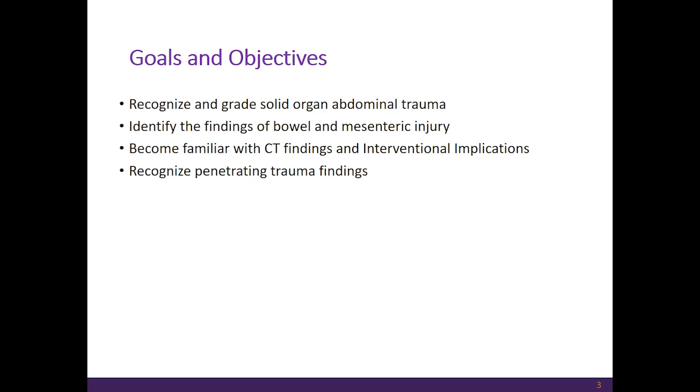So our goals and objectives, hopefully by the end of this talk, you will be able to recognize and grade solid organ abdominal trauma. Hopefully you'll be able to identify the findings of bowel mesenteric injury. You'll become more familiar with CT findings and interventional implications, and be able to recognize some of the signs of penetrating trauma.